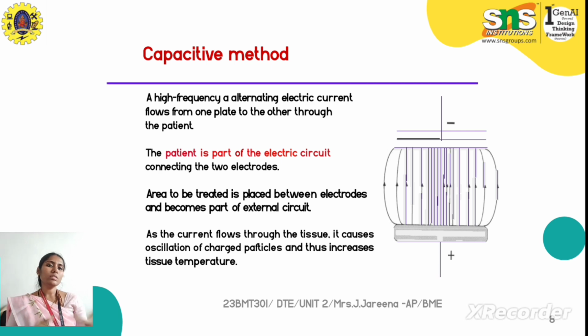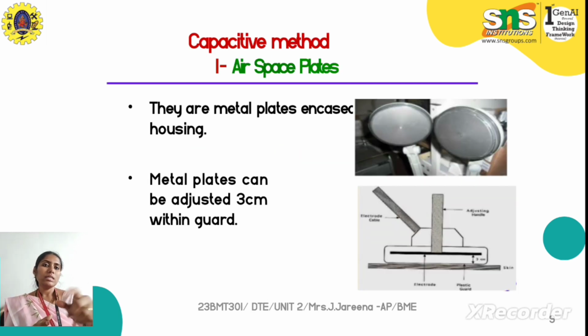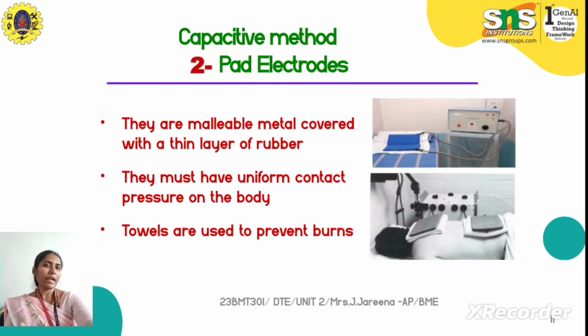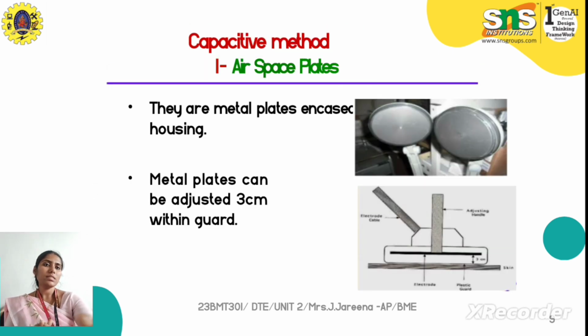So through this way we are inducing the heating effect inside the body by the mechanism of the interaction of biomolecules inside the tissue. So the subtypes of this capacitive method are, one is airspace plates, another one is pad electrodes.